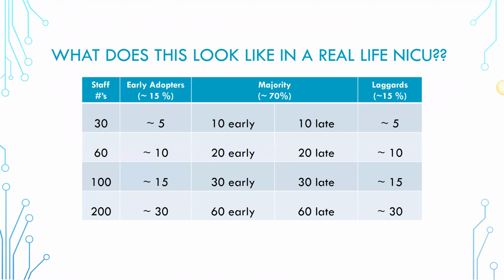So like a single time image or something. Bedside brain monitoring is real time, and that's what I love about it. It's important to know that aEEG isn't a replacement for full continuous EEG monitoring. I think that when I first started teaching about aEEG, this was the biggest concern that our neurology colleagues had. It's not considered a diagnostic tool, and it's also not a new tool.